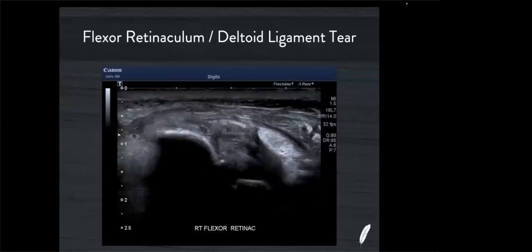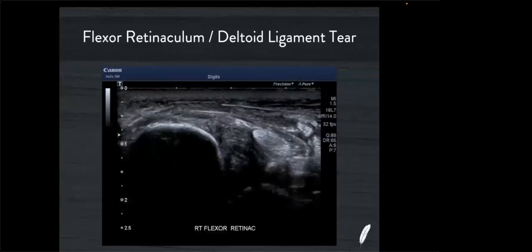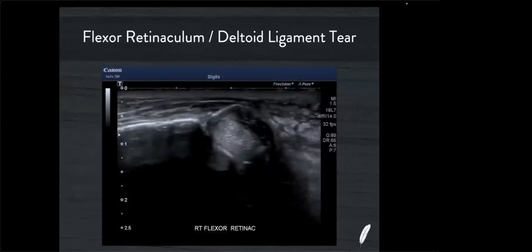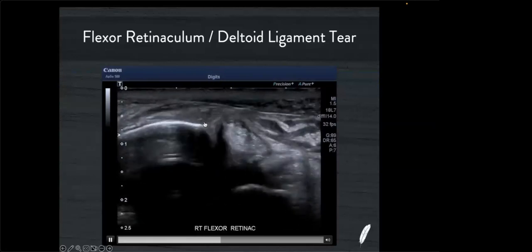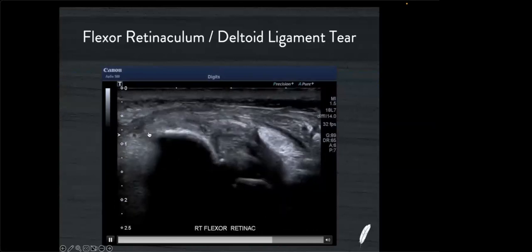The other injury that we see when we try and separate our hindfoot from our tibia and fibula is separation injuries of the deltoid ligament complex. You can see as I'm coming down through tibialis posterior here, you can see this sheet of white echogenic material here. And that's a piece of periosteum that used to be attached to the bone here. So this is a classic injury.